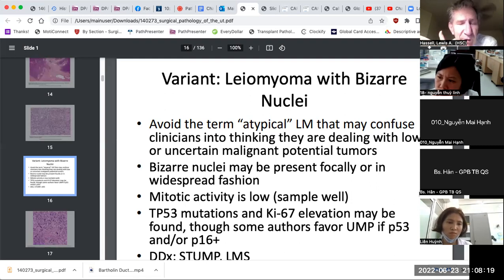The other pattern that we see in endometrial serous tumors from time to time is a diffuse cytoplasmic and nuclear staining. I don't know that that's been described in smooth muscle tumors, but that also is a mutated status that is associated with the TP53 mutation, at least in endometrial cancers and serous tumors of the ovary.